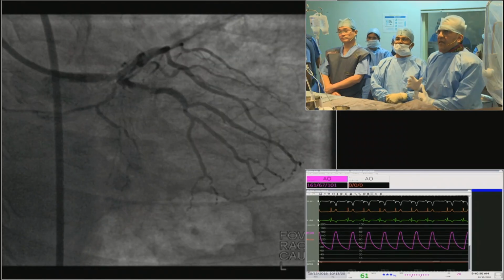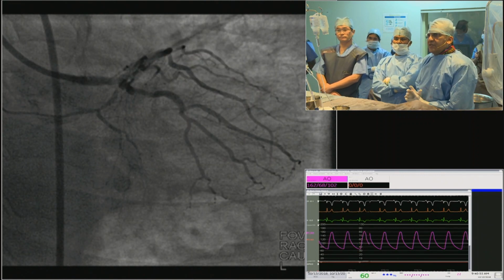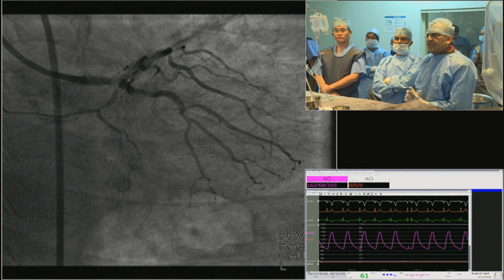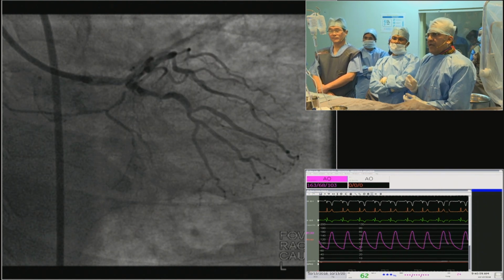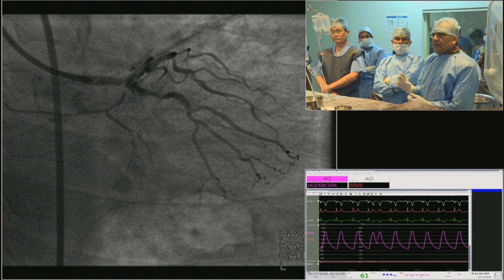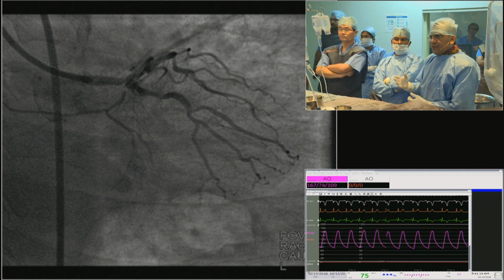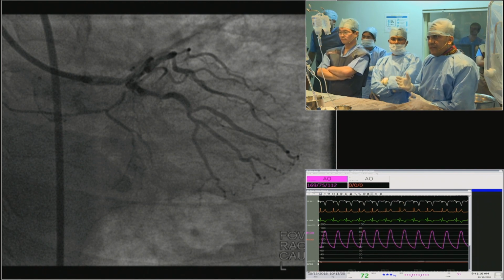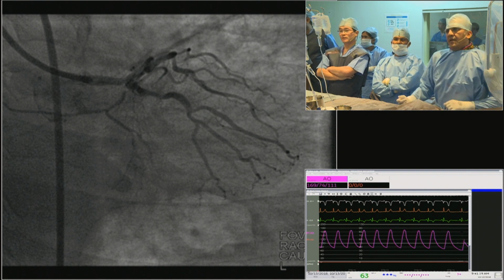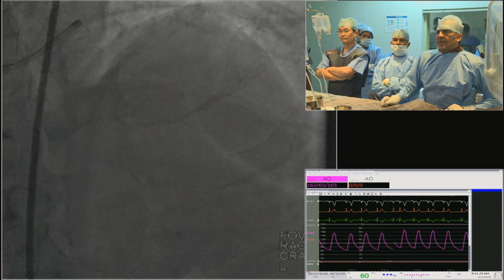So in the left coronary angiogram, the lesion in question was that distal left main, which is just before the bifurcation, and it kind of wants to kiss the ostium of the circumflex. There is a little eccentric plaque in the proximal circumflex, and then there is what looks like a moderate stenosis in that horizontal part of the circumflex before it curves into those 3 OM branches, the top one, the second one, and the third. Now, the other one, go to the next view, please, the LAD, cranial.